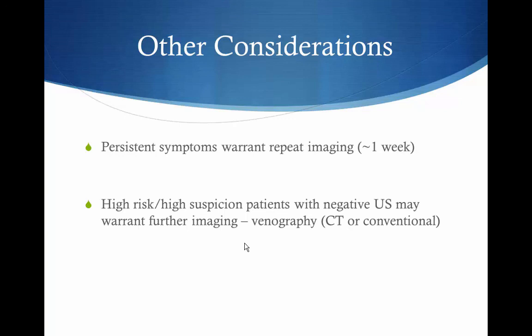And then remember, even in a vascular lab that does 1,000 ultrasounds a day, there still is a small miss rate. So for patients that are very high risk and very high suspicion, even with a negative ultrasound, no matter who does it, they may warrant some other imaging like venography. Probably this day and age, we're doing CT venography more often, but that's something to think about. Sometimes there are false negatives, no matter who's doing the scan.